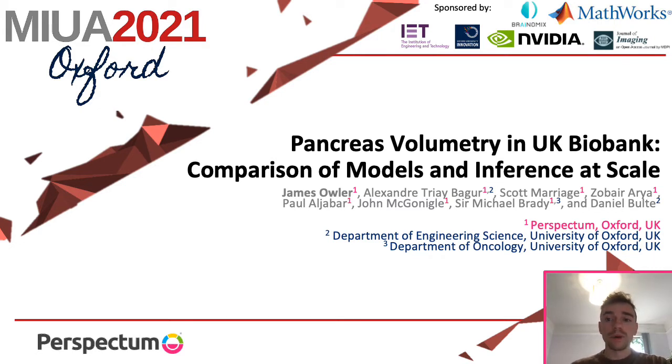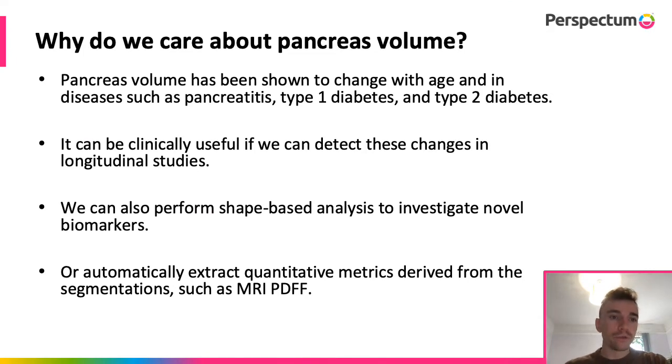Today I'm going to talk to you about a piece of work looking at how we can more accurately measure pancreas volume from UK Biobank data and present some interesting findings from this data. Hopefully this presentation will demonstrate how we can leverage these massive datasets alongside deep learning based segmentation to produce some clinically meaningful results. First of all, why do we care about pancreas volume?